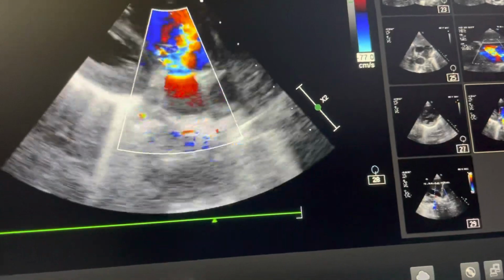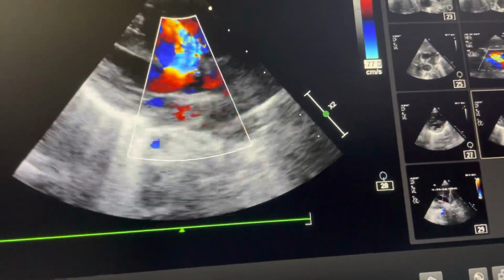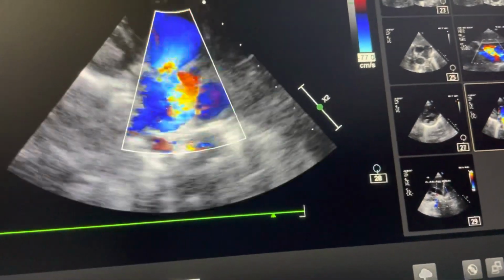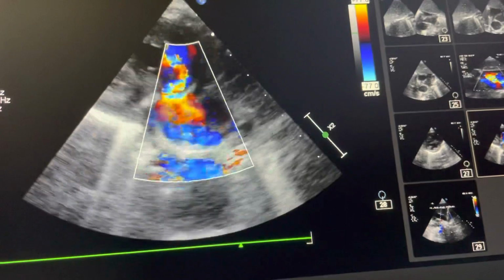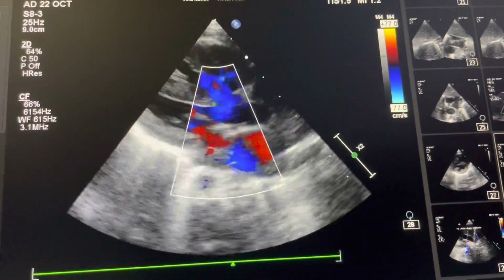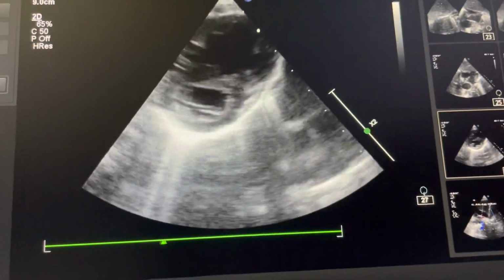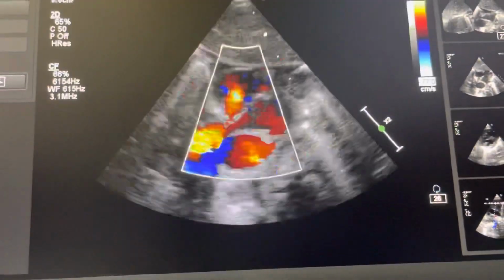Significant pulmonary stenosis is seen, pulmonary regurgitation also seen. Pulmonary regurgitation suggests to us the pulmonary valve is dysplastic, not well formed, defectively formed. So overall, this case has TOF physiology. We can say TOF, or second diagnosis, we can also say malaligned VSD with severe pulmonary stenosis.